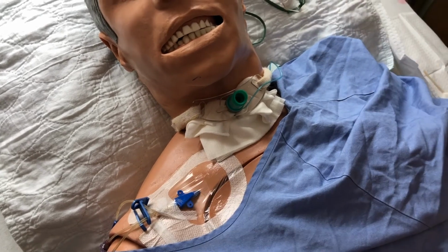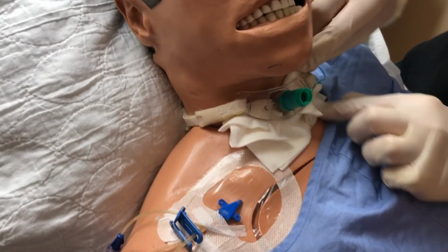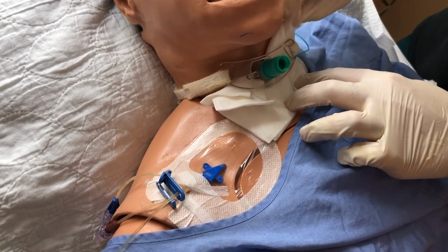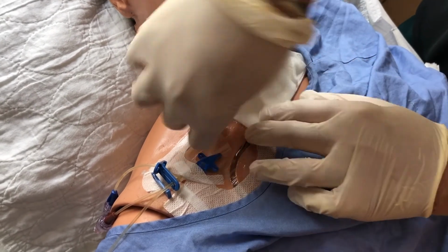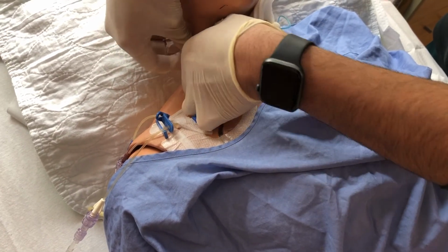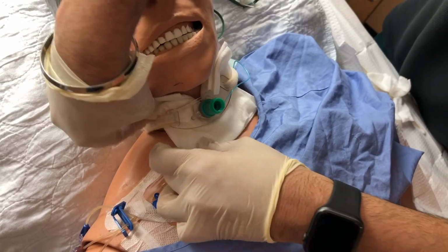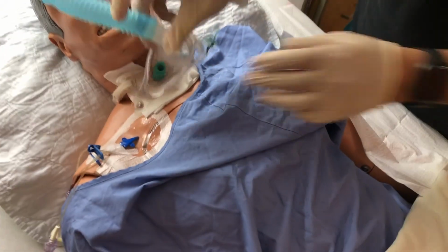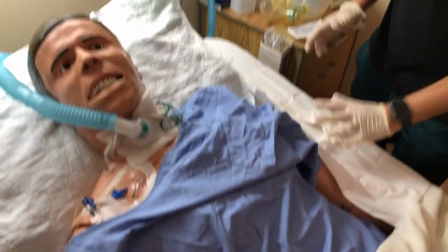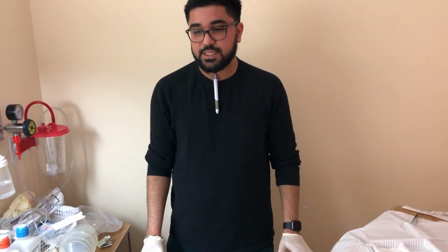And at this point, you can use your hands, making sure you're not touching the inner portion of the stoma. Pull this up as such, making sure to keep the inner stoma sterile. I would put the oxygen back on at this point, make sure my patient is okay, clean up my mess, and assess everything, do a safety check, document, and I'm good to go.